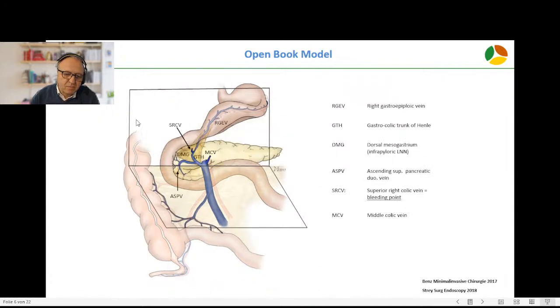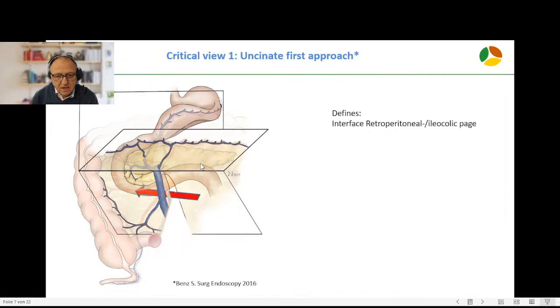It's getting clearer if you remove the transverse mesocolon and look at the mesogastric structures. The gastropiploic artery and vein and the mesogastric fat pad remain in situ, as well as the gastropiploic trunk of Henle and the pancreatic veins.